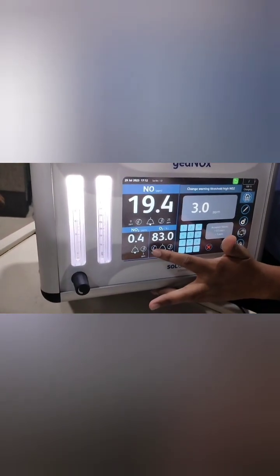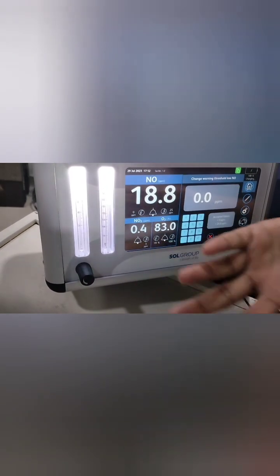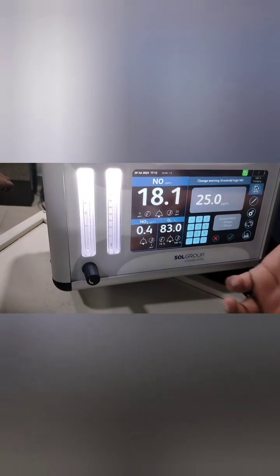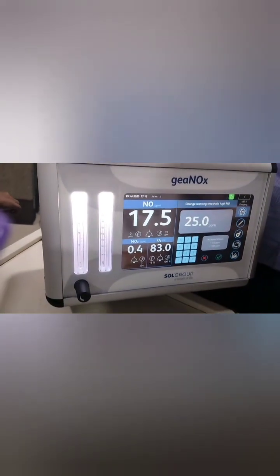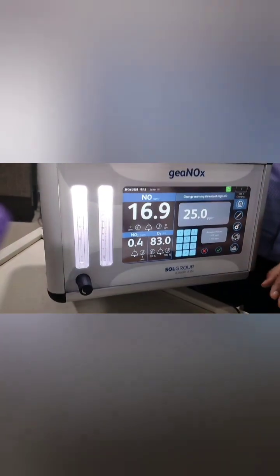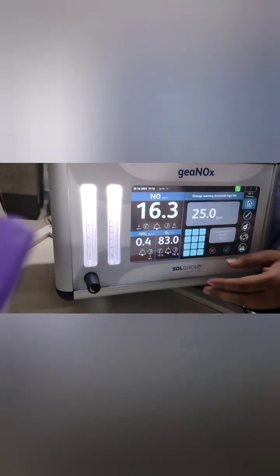You can also set the iNO alarm limits here — set the lower alarm limit to 5 and the upper limit to 25, similar to pulse oximetry alarm limits. This prevents alarm fatigue. If you set the limits too narrow — for example, 21 — it will give frequent alarms; if set too low, like 1 or 2, it will also trigger unnecessary alarms.